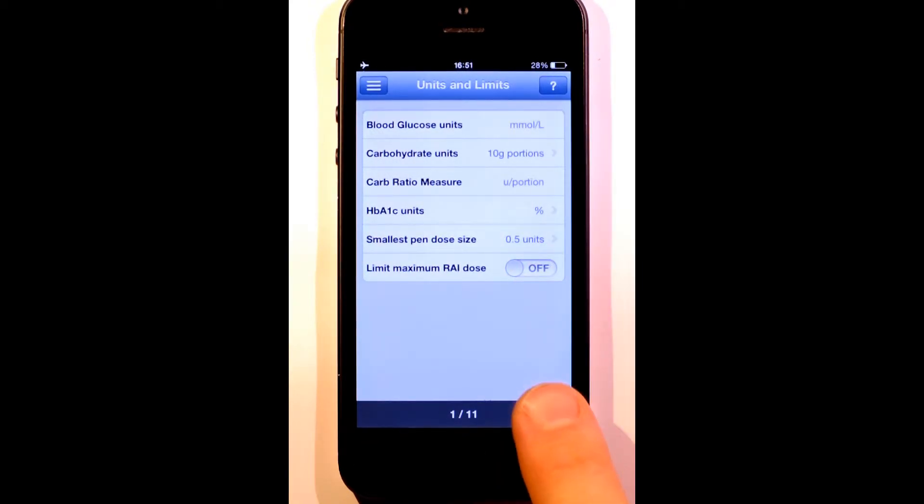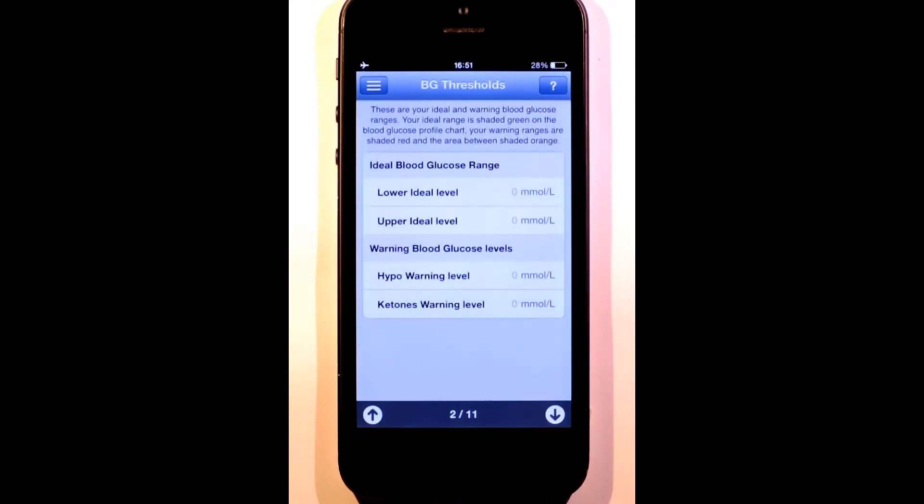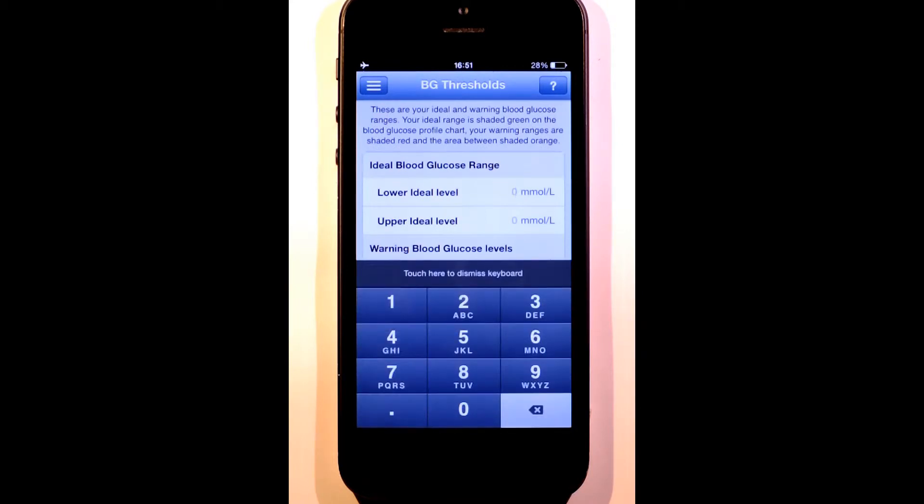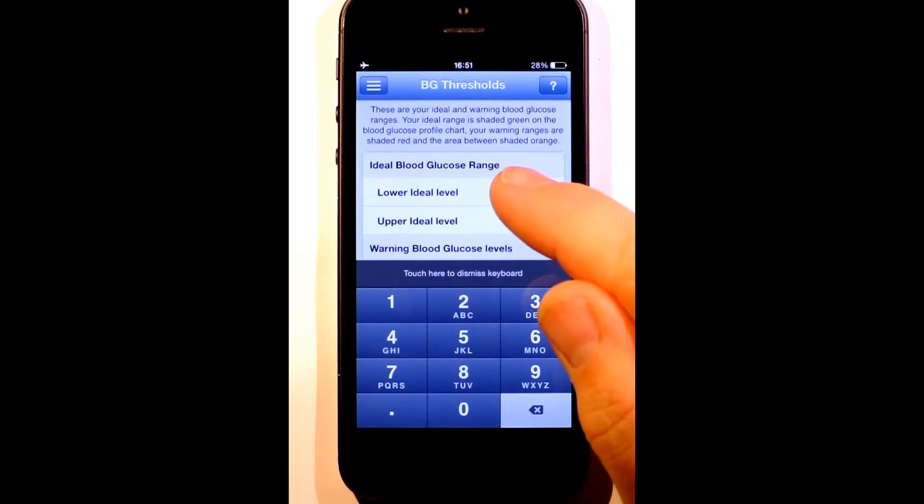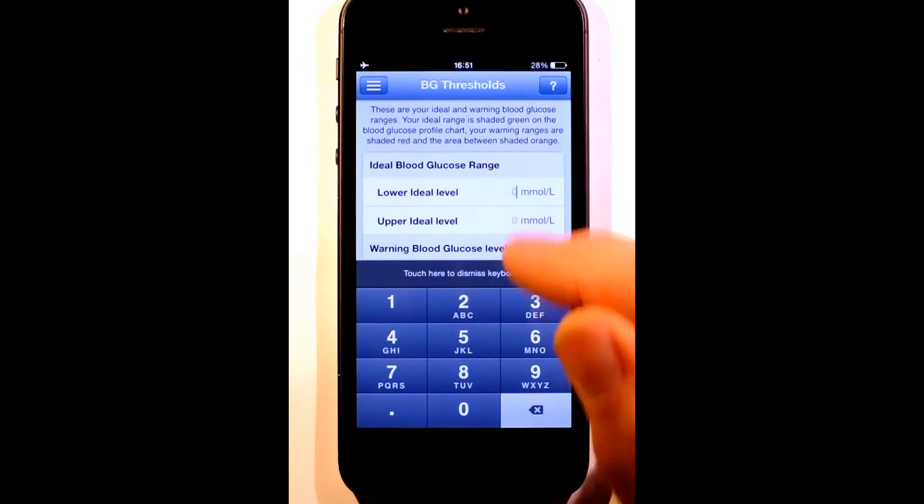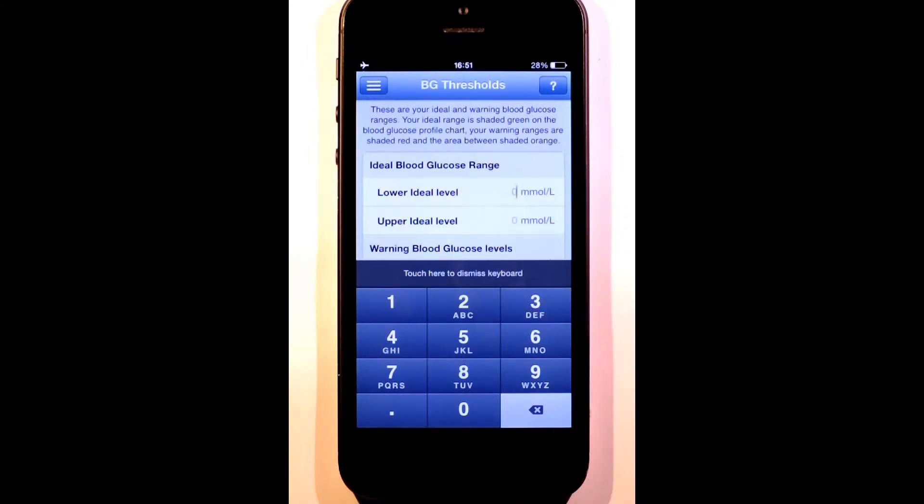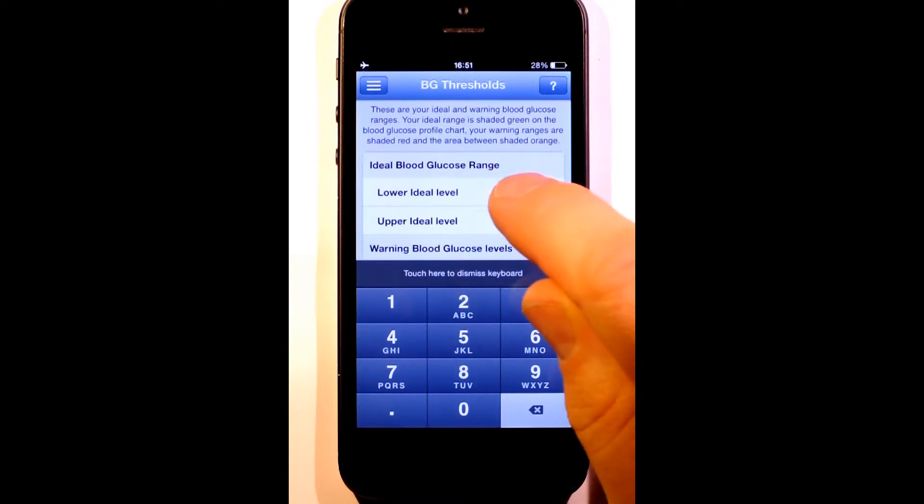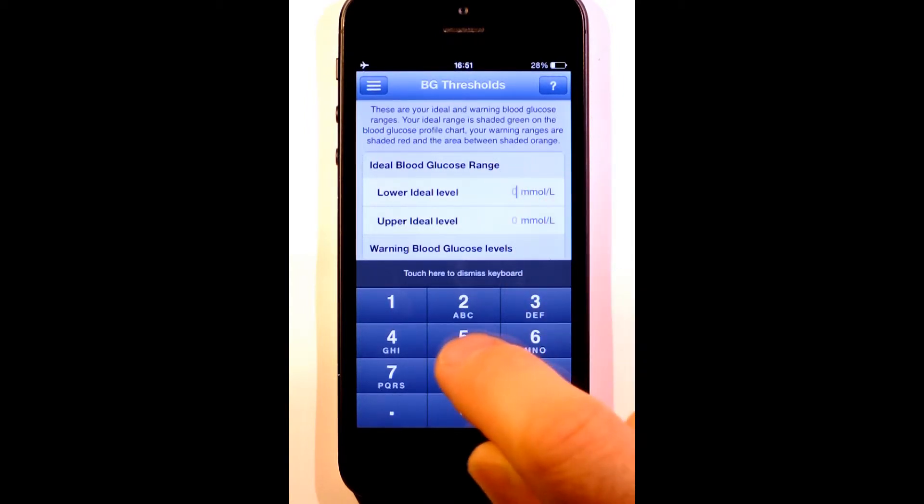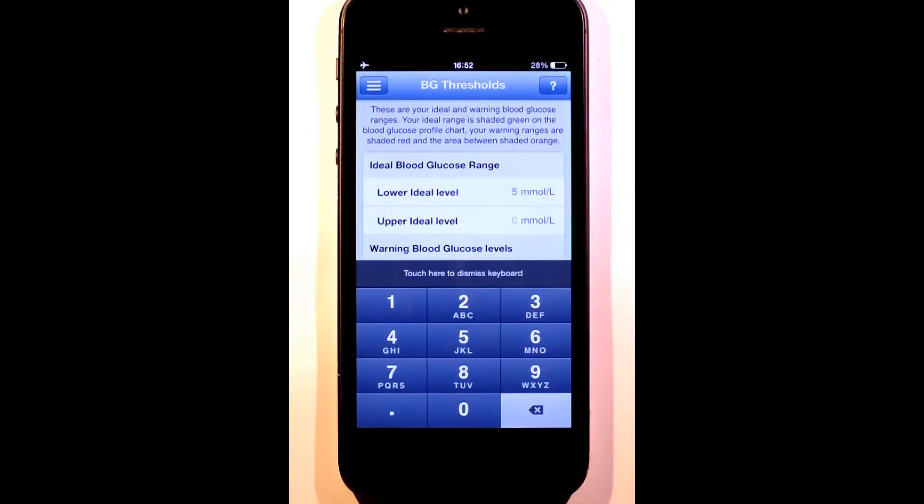The next step is blood glucose thresholds. These set the green, red, and amber color bands. First we'll set the lower and upper values for our ideal blood glucose range, and this will be our green band. I'll set the lower limit to 5 mmol per liter because I'm in the UK and that's the minimum requirement for driving.